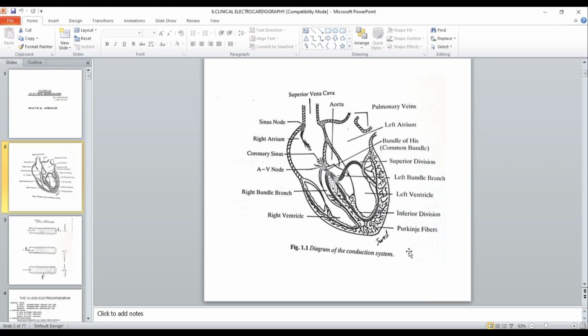Therefore, in the diagnosis of cardiac disease, the electrocardiogram should be interpreted with the clinical history, age, sex, weight, drugs being used, and associated clinical conditions.